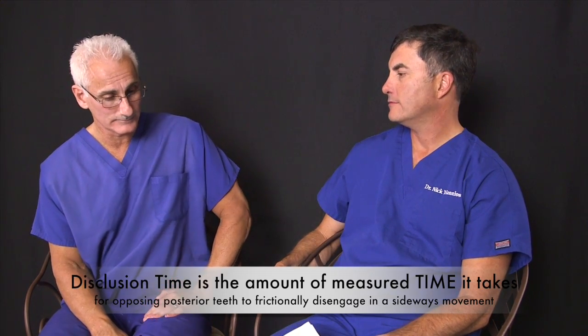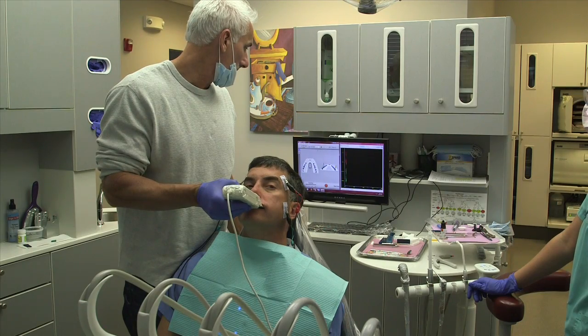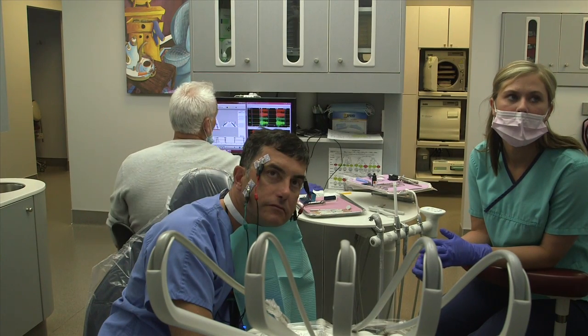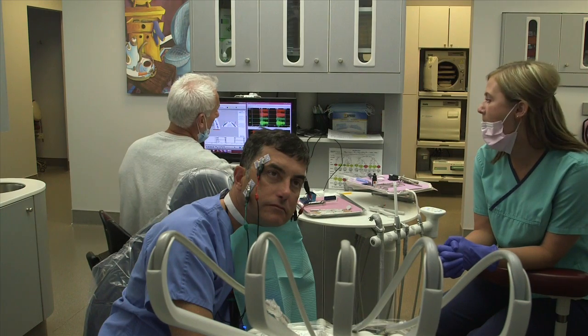On a personal note, today we looked at me with the link and with the T-scan, and you pulled out the old data from 4 years ago when I was DTR'd, and the numbers were almost the same, within about a tenth of a second. Which is what the research shows, that the disclusion time will lengthen about a tenth of a second. If it's 1.6 seconds in right excursion pre-treatment and it ends up 0.45, it won't be 1.2 seconds three years later. It'll be 0.55. And that's almost perfectly in line with what I saw today.